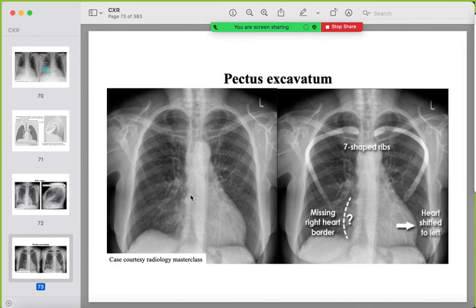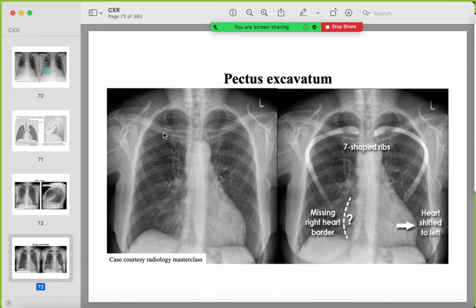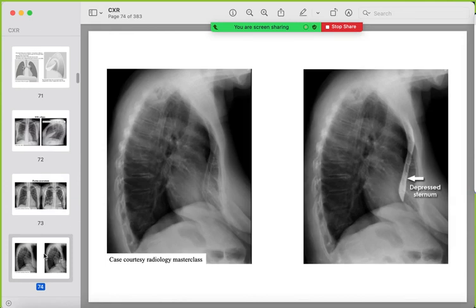A mimicker for right middle lobe collapse is pectus excavatum. The right heart border may not be visible, but the patient has no signs of infection or tumor. The ribs show horizontal posterior ribs and S-shaped anterior ribs. The sternum is depressed. Always check clinical examination, previous lateral radiograph, or CT to confirm.